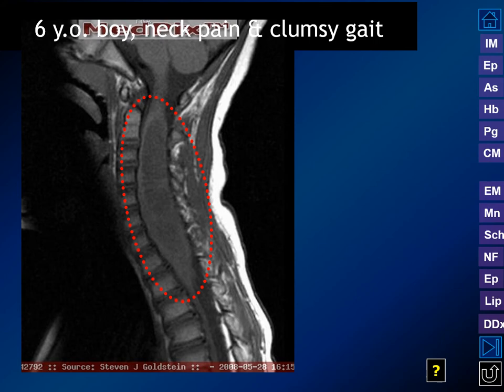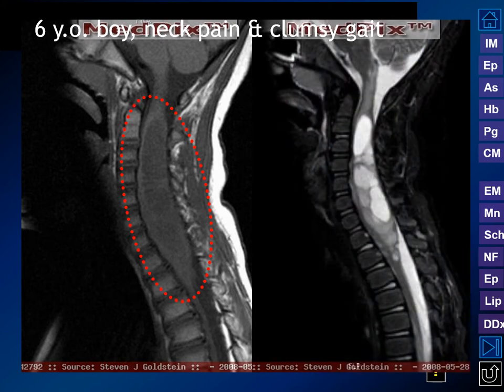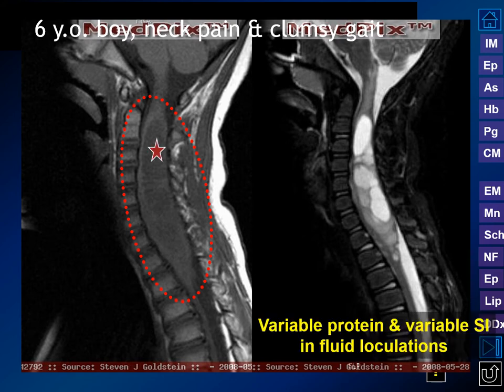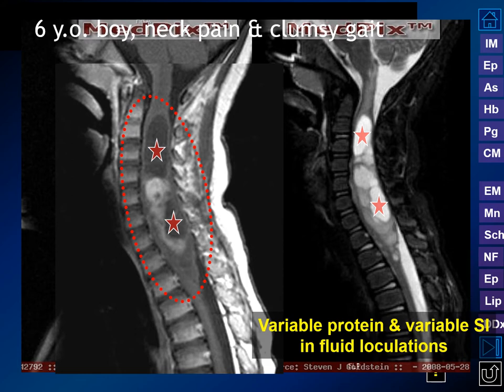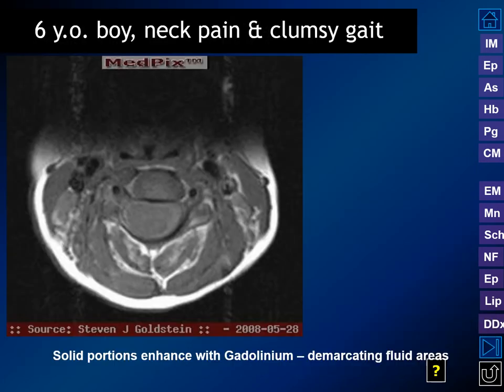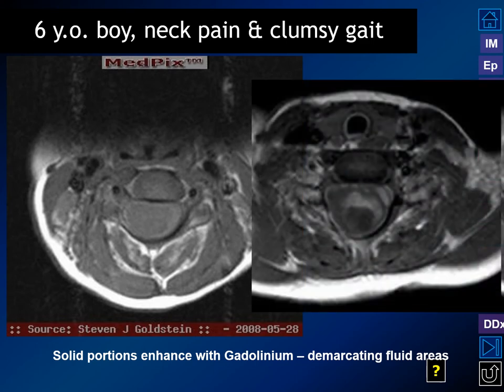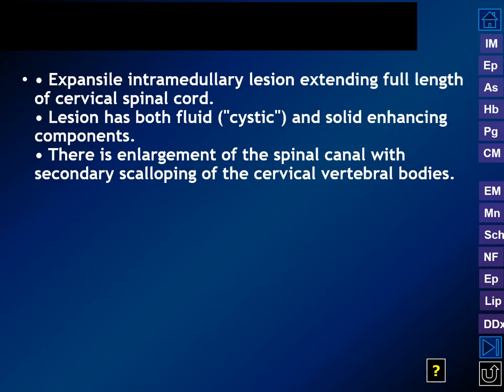This is a six-year-old boy with neck pain and clumsy gait. A dramatically expanded cervical spinal cord is seen, slightly heterogeneous. On T2, there are fluid-like areas of varying signal intensity. Any time you see fluid in the cord, you must give contrast, because it could be tumoral cysts or secondary syringohydromyelia. After contrast, we demonstrate the solid portions of the tumor — some areas that appear fluid-like on T1 and T2 are actually solid tumor regions with microscopic cysts. In cross-section the lesion is extensive but not exactly centrally located. This expansile intramedullary lesion with fluid and solid enhancing components was a pilocytic astrocytoma.